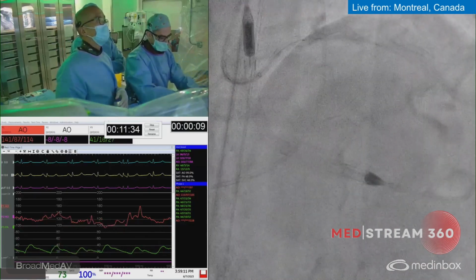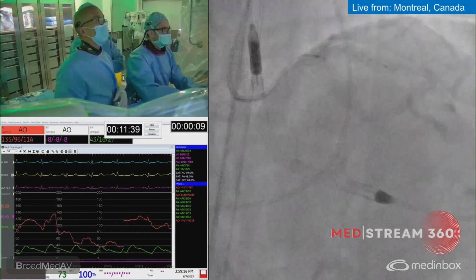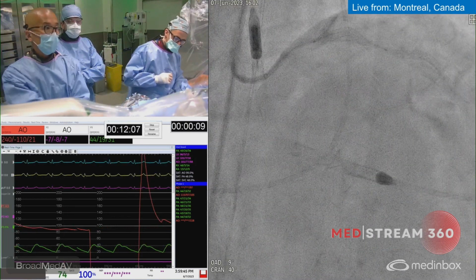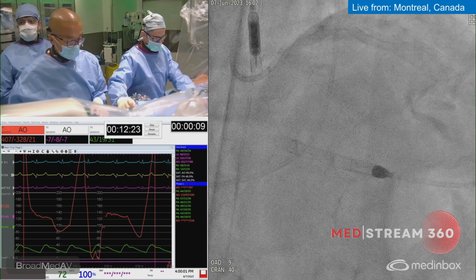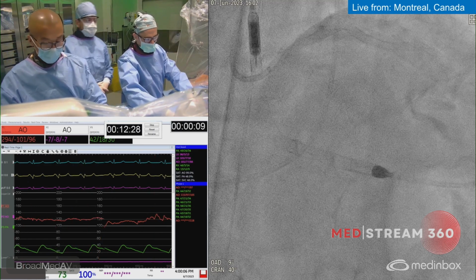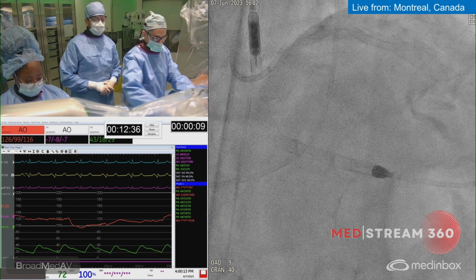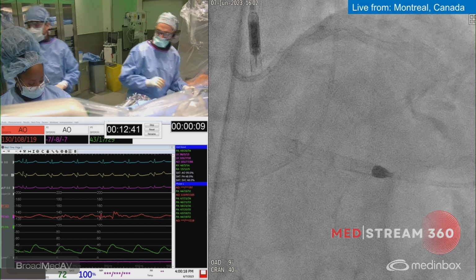We have, obviously for complex PCI, we always want to be sure that we get to see the left main. Okay, let's bring it down. Okay, that's good. All right, bring down. Go whenever you're ready. Don't inject the whole thing because it's short. We'll see if that position at the level of the left main is fine. If you can focus now on the OCT, we'll see.